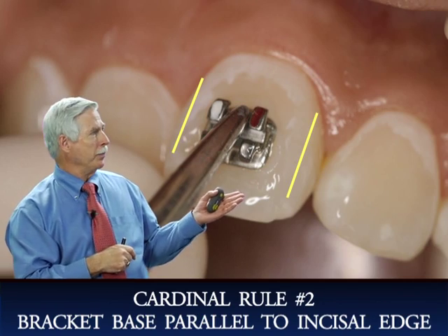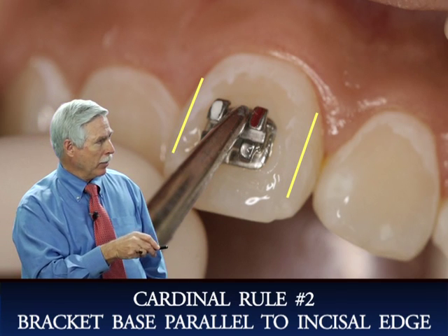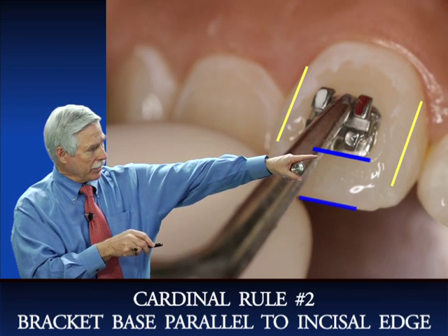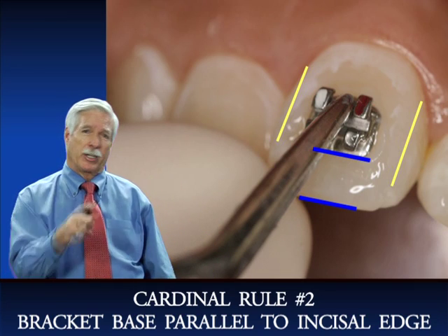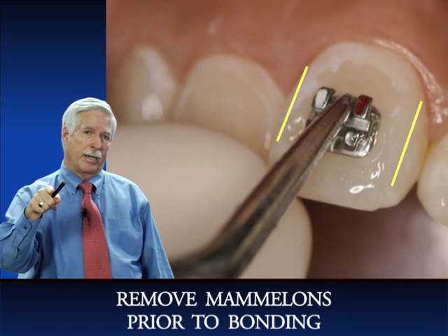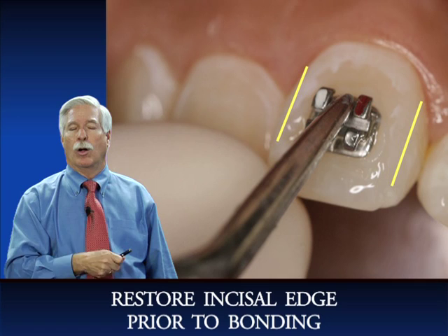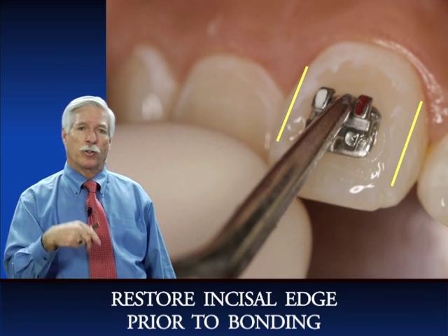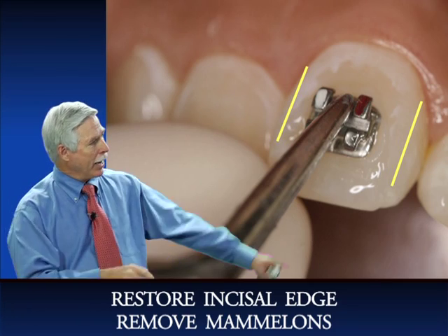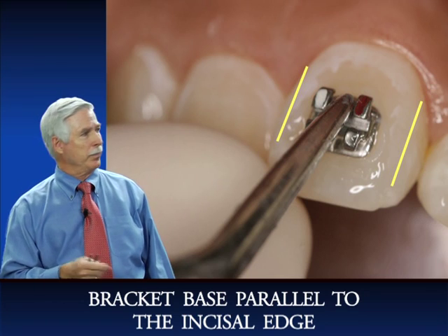The next cardinal rule is the base of the bracket must be parallel to the incisal edge. You can see the base of the bracket here is parallel to the incisal edge. Now, what if your incisal edge has mamelons? Well, you want to remove the mamelons. What if your incisal edge is cracked? Well, you should restore it first. So do your restorative work before you put the bracket on. Remove the mamelons and make sure the incisal edge is parallel to the base of the bracket. So that's cardinal rule number 2.